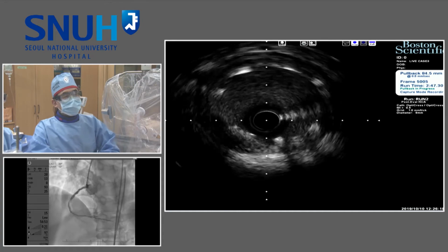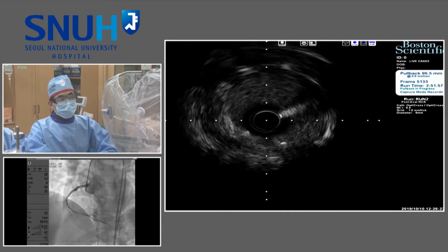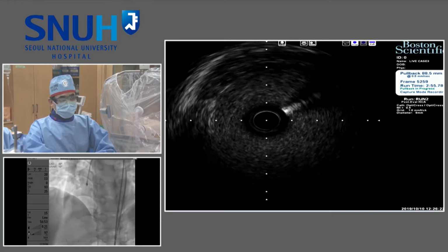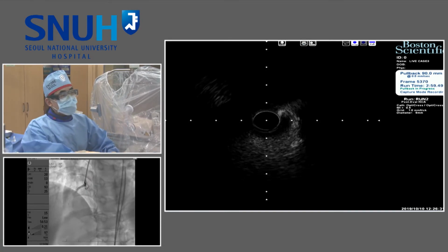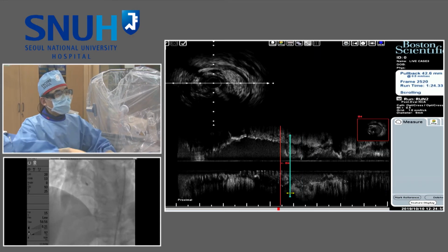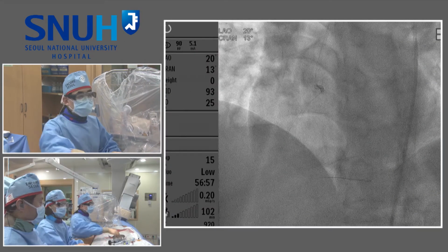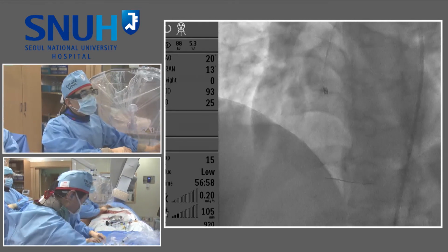Okay, this is RCA ostium. So stent apposition was good. So prolonged inflation, then full expansion is kind of effective. Okay, I adopt a 2.75 short stent. Good. How short? Now do it fast because you've got 3 minutes to show us. You know, in the longitudinal view of the IVUS, you can clearly see some length of the injured segment.